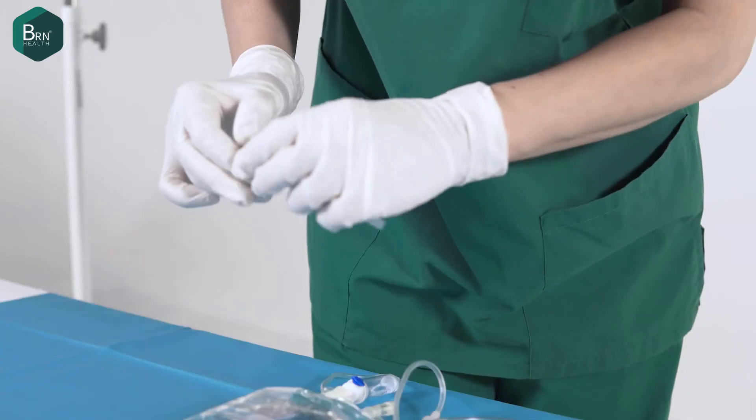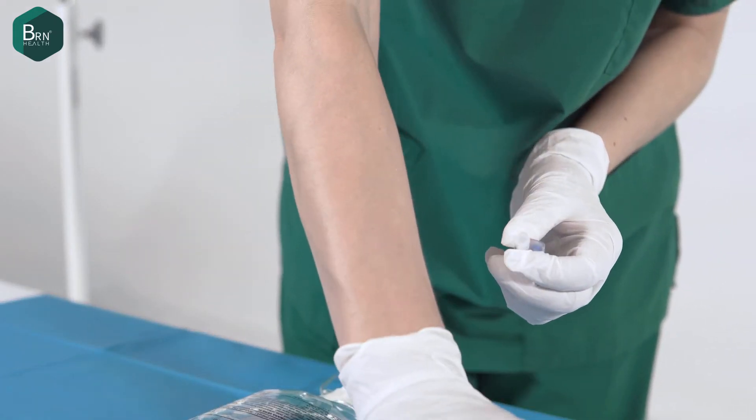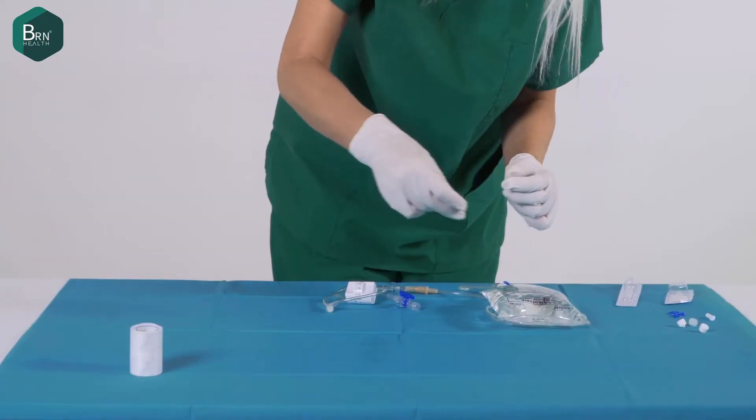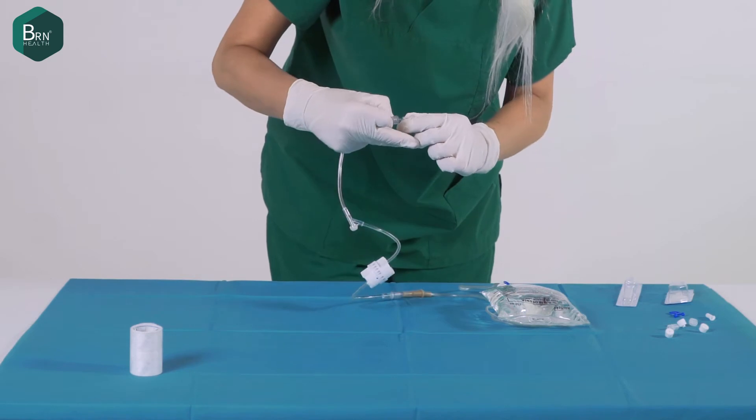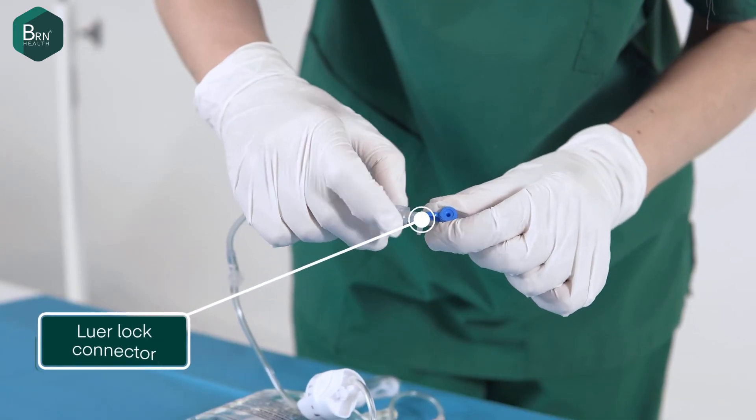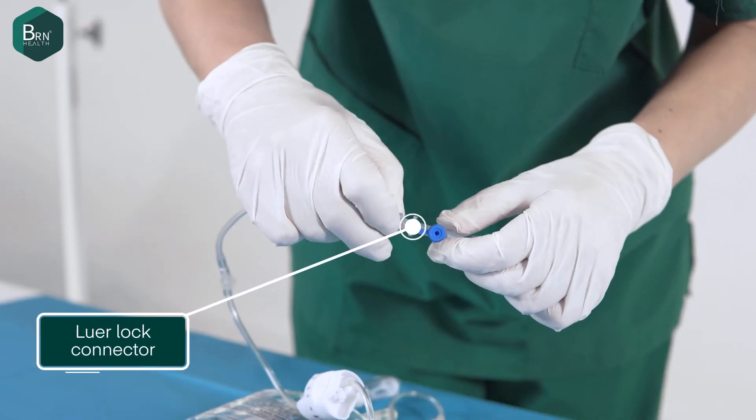The needle is carefully attached to the patient to prepare for the infusion procedure using the three-way stopcock. Turn the female luer lock and then lock the male end firmly to avoid any leaking during the infusion process.